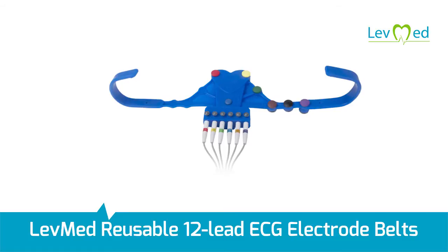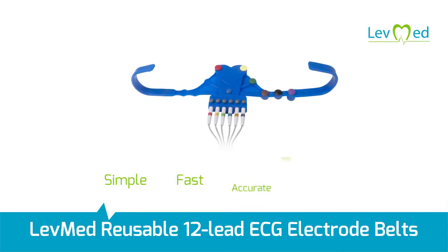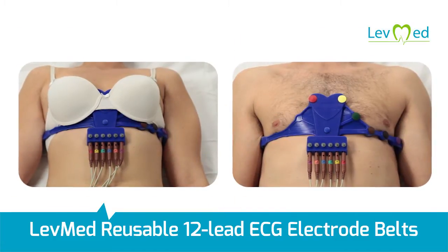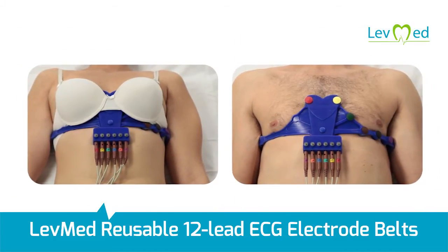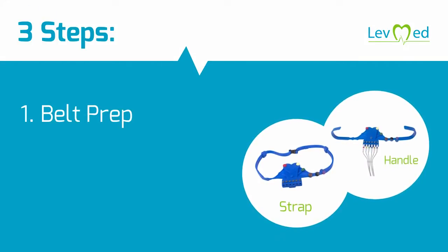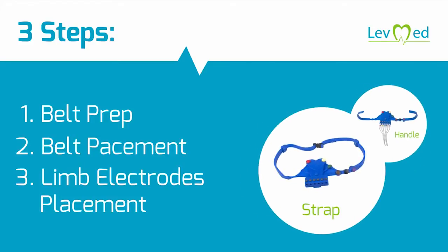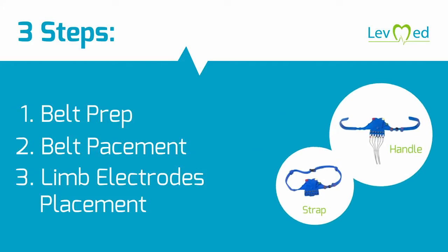LevMed reusable 12-lead ECG electrode belts enable simple, fast, accurate and reliable assessments for both men and women of all body shapes and sizes. This video will demonstrate the three-step application process of the two LevMed universal ECG belt models: the universal strap and the universal handle.